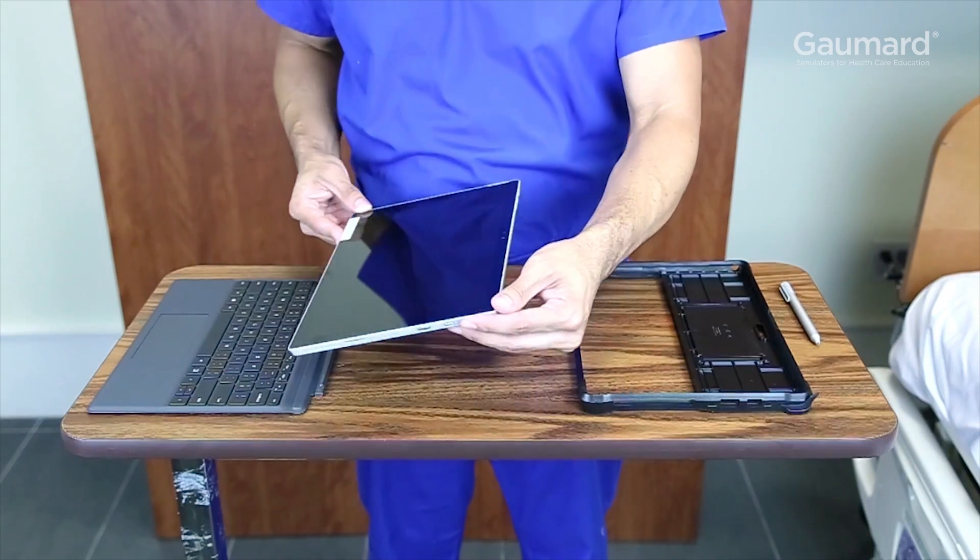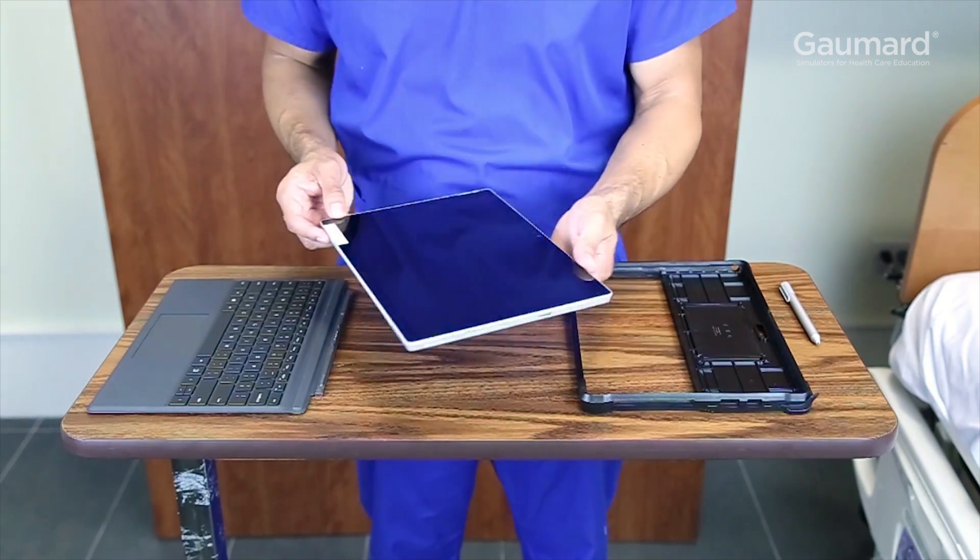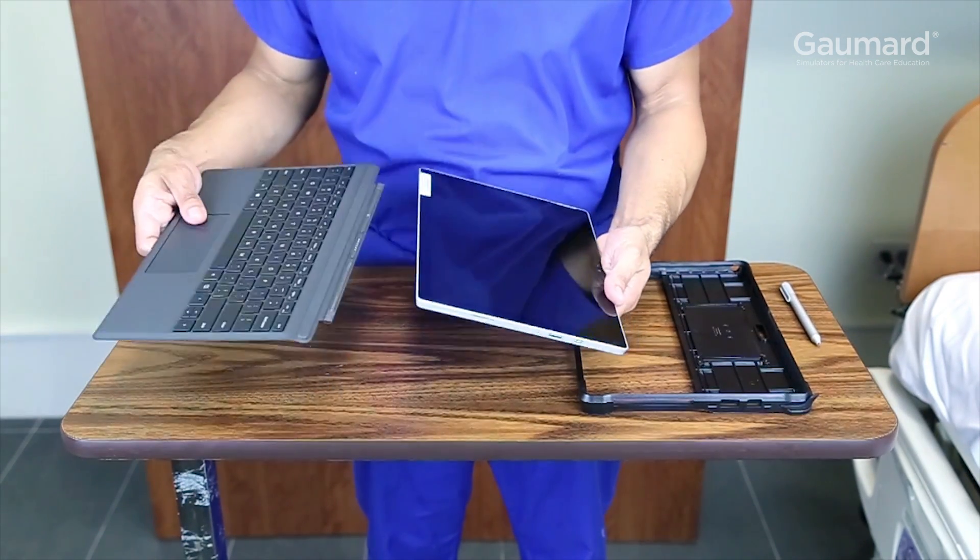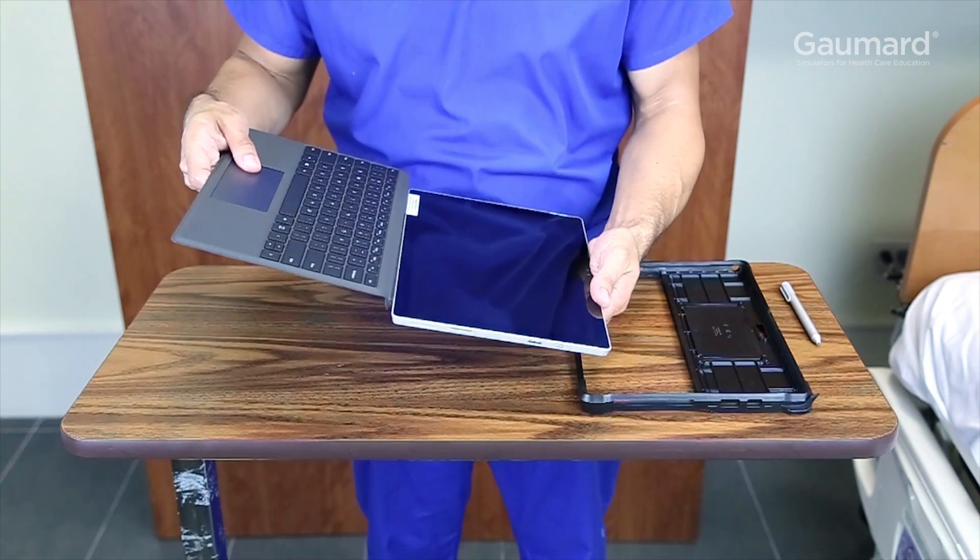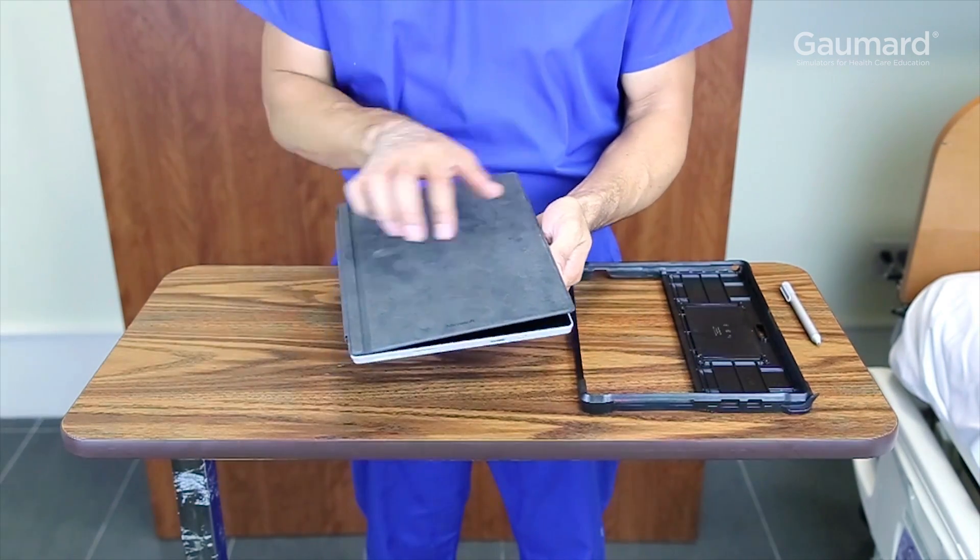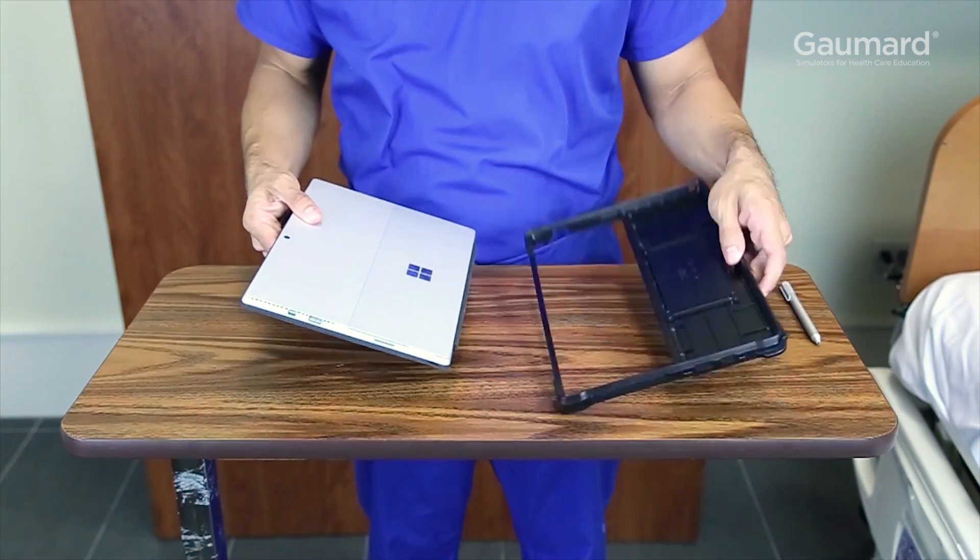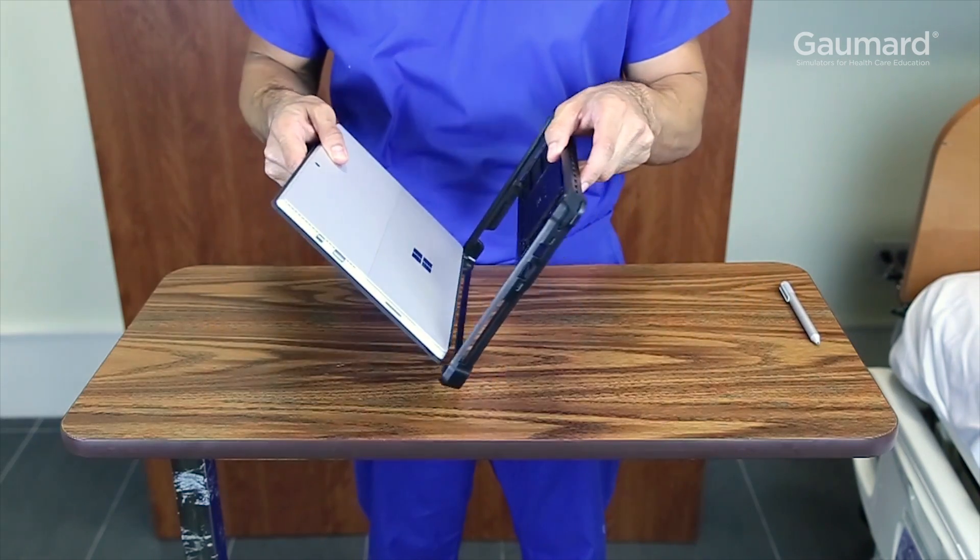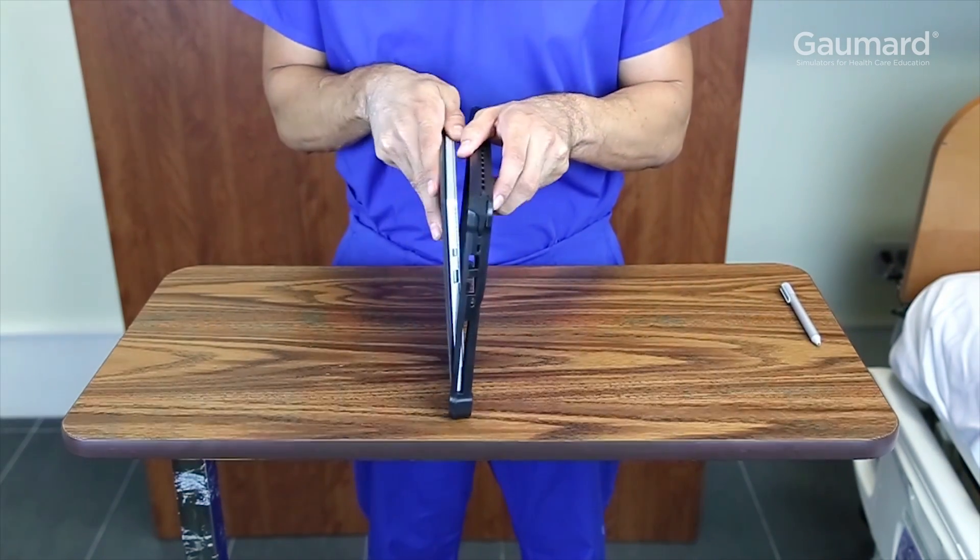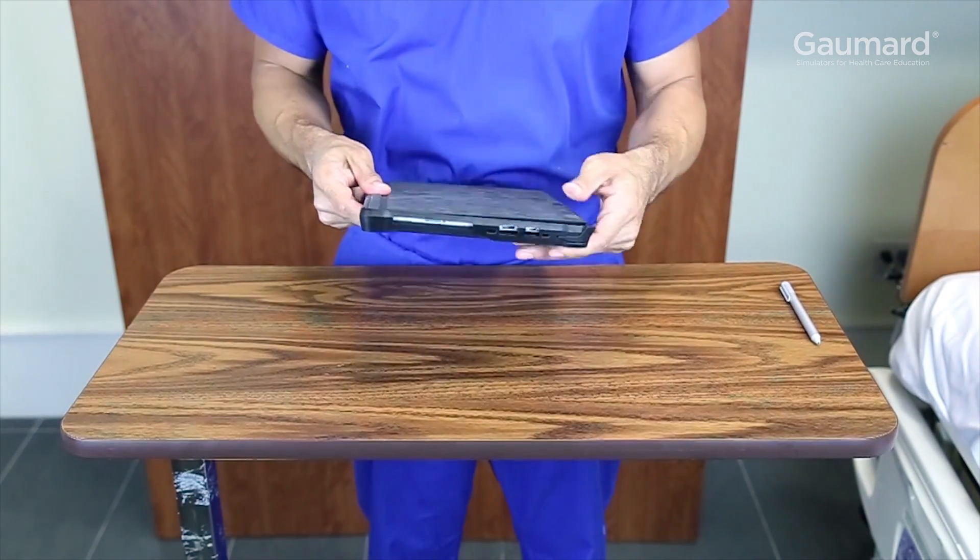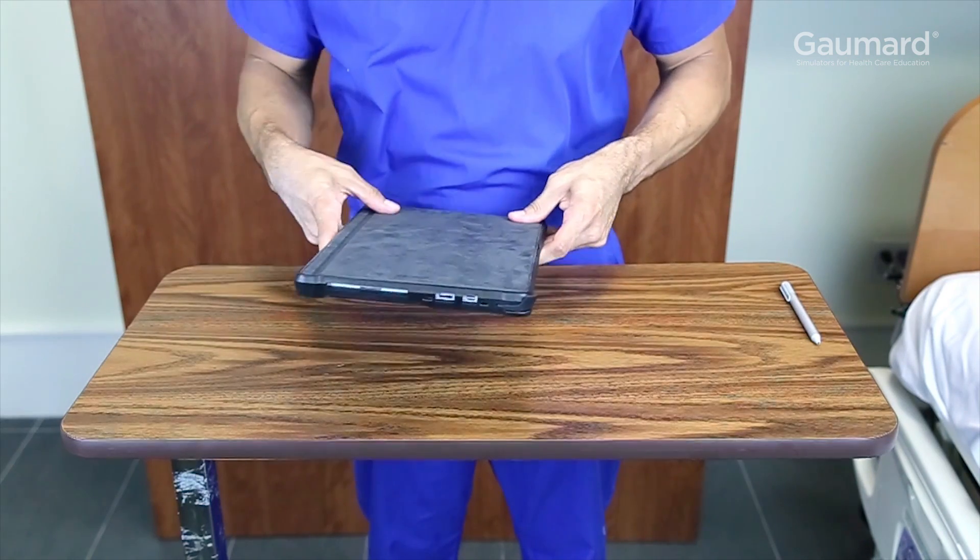The box with the tablet includes a type cover and a protective case. There is a magnetic receptacle for the type cover on the bottom side of the tablet. Once the type cover is on, fit the case on the back of the tablet. Gently press the corners and the borders of the tablet to snap it into the case.